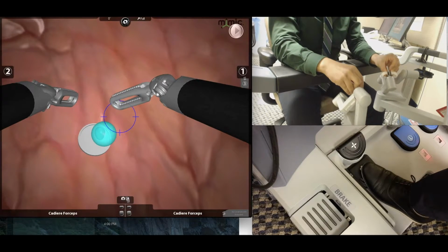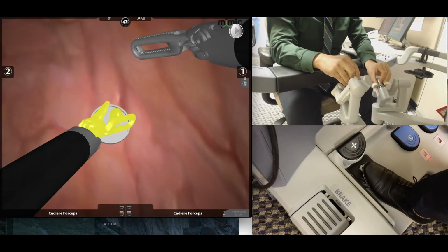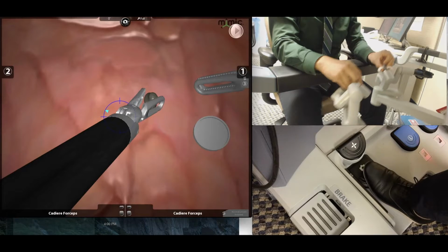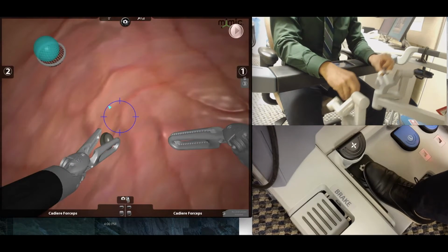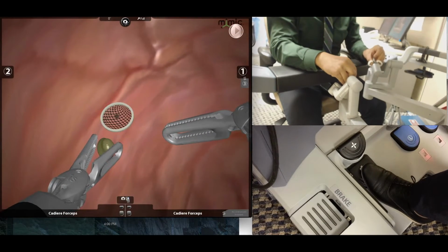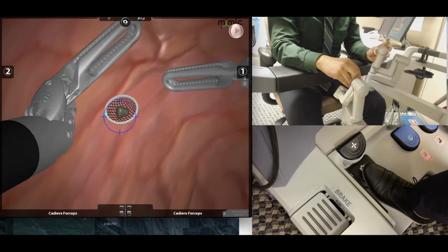Once you become comfortable with the task, you may attempt to move the camera in more than one horizon. If you notice here, looking at the blue arrow, I am both moving the camera towards the target as well as rotating it in an anti-clockwise direction. To accomplish this, I maintain the blue arrow in between 2 points on the crosshairs, allowing me to travel the shortest distance in the fastest time.